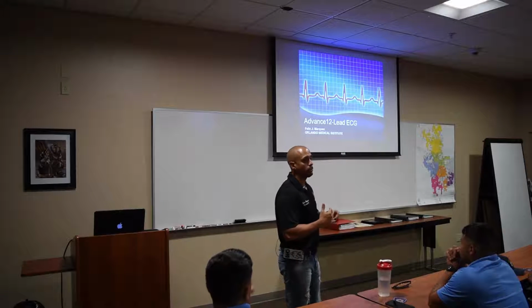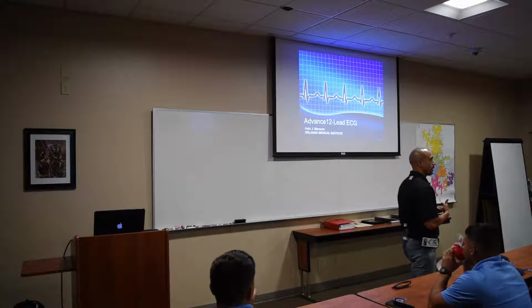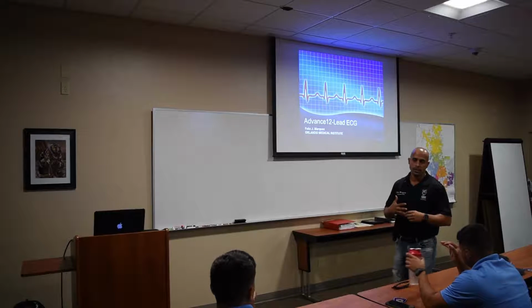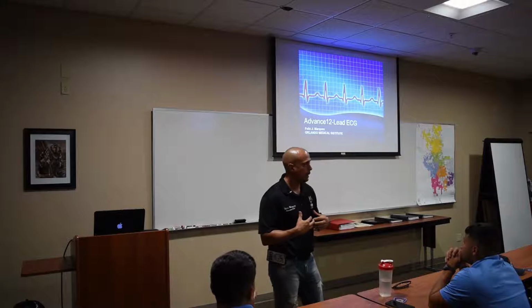Medic, and one, put in 12 lead on. Placement is key. If you put them on poorly, you're going to get a poor reading of ECG. So if you put them on correctly, you're going to get a good reading of ECG. So placement's important. I know a lot of medics rely on their EMTs to put it on properly.